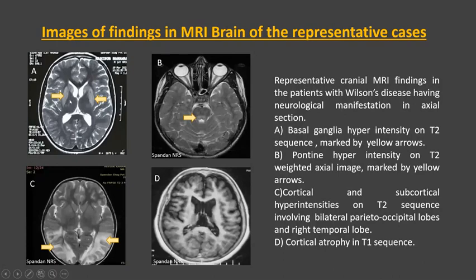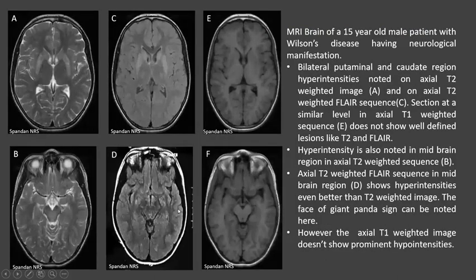Representative cranial MRI findings: Image A shows basal ganglia hyperintensity on T2 sequence. Image B shows pontine hyperintensity on T2-weighted axial image. Image C shows cortical and subcortical hyperintensity on T2 sequence involving bilateral parietal-occipital region and the right temporal lobe. Image D is a T1-weighted sequence showing cortical atrophy.